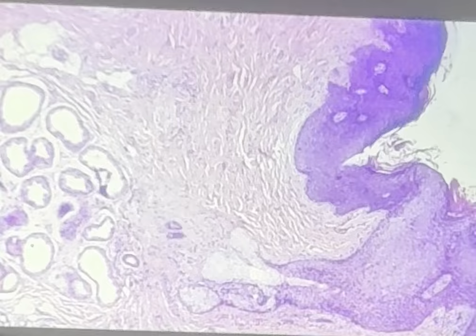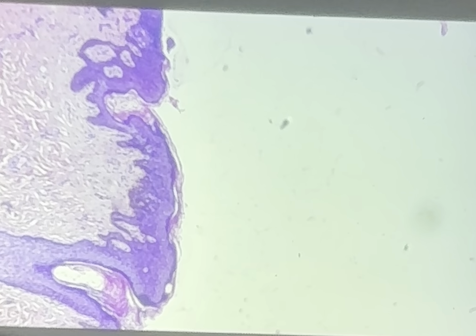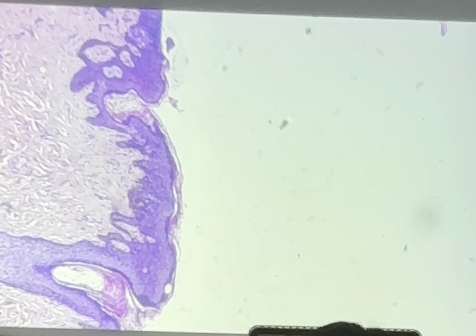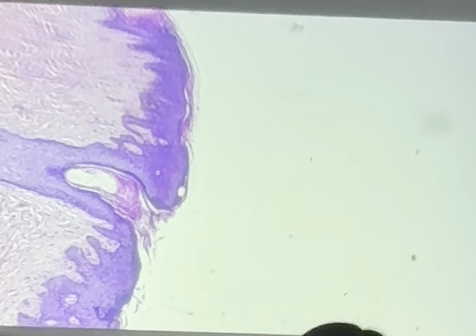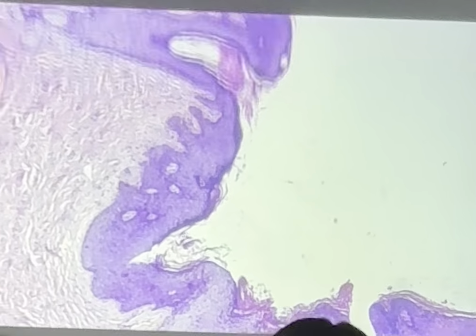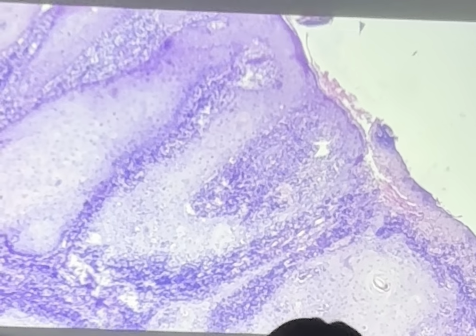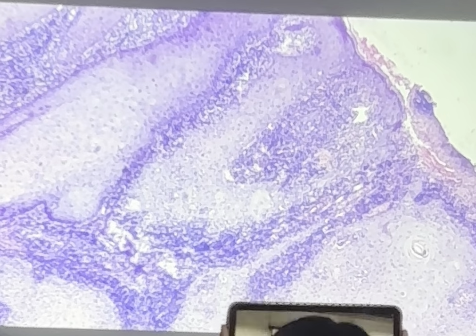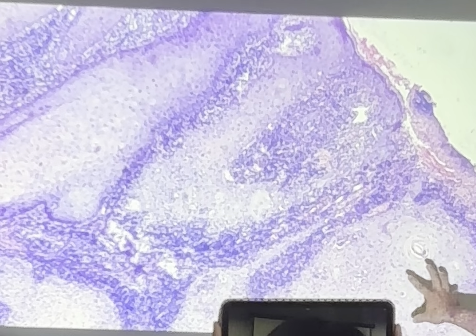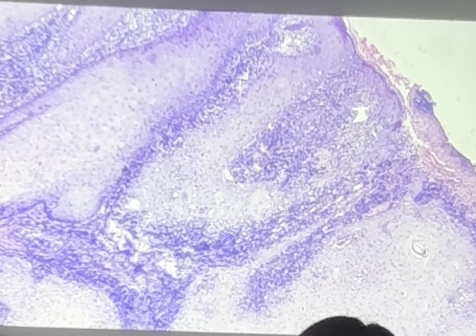Alright. So what is this organ here? I know it's sideways because I can't rotate it. Skin. Keratinized, stratified squamous. Correct. But we see something here. What happened to the skin here? We see a lot of inflammation again. But we see these cells that are going down into the dermis. It's already invading the dermis.